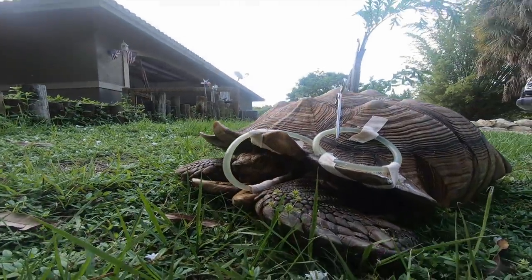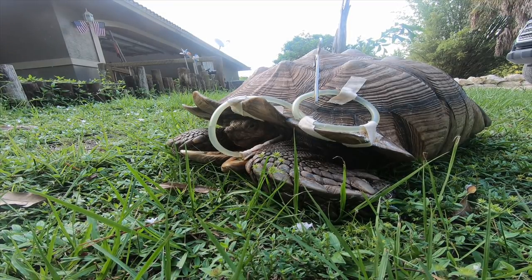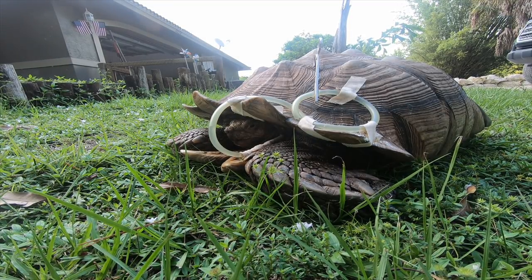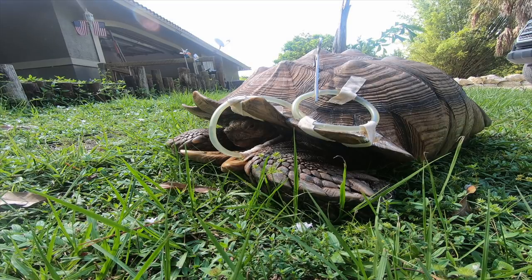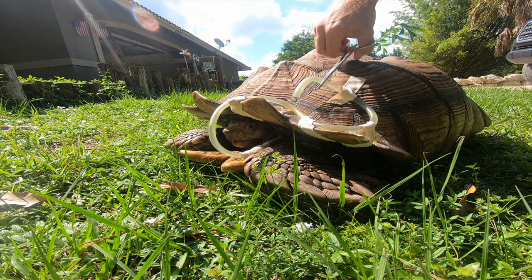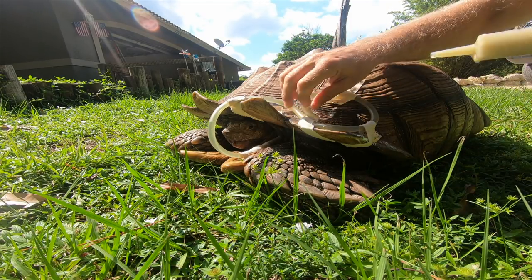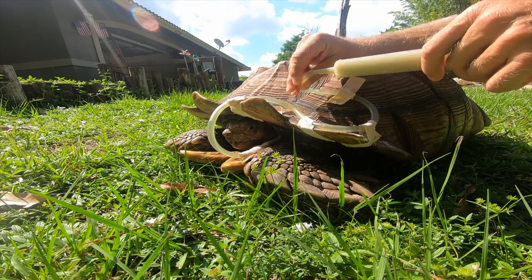And of course, when I'm done feeding him the food, I'm also going to have to go back and run some fresh water through the tube to make sure we don't have any issues with any of the materials in the food blocking up this situation. But I wanted to give you guys the real scoop on how you really have to take care of your animals when they're sick.